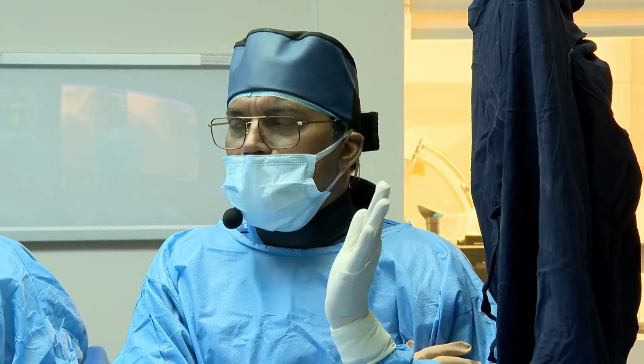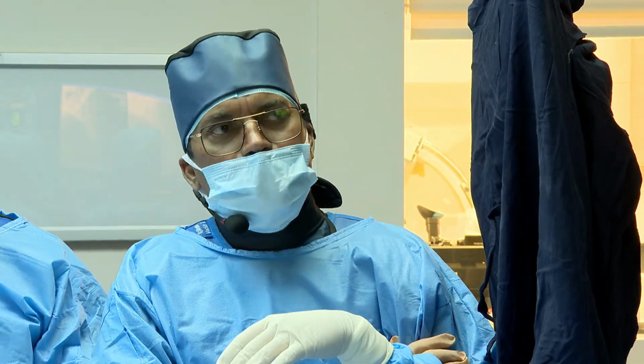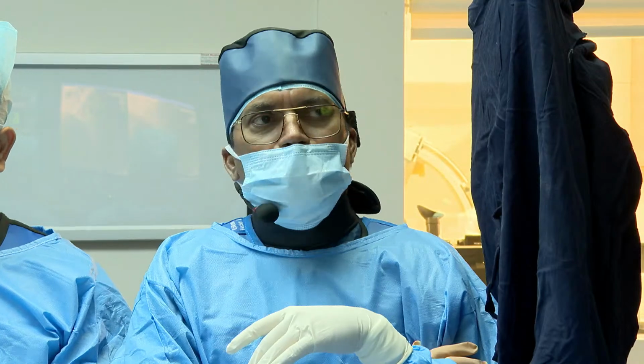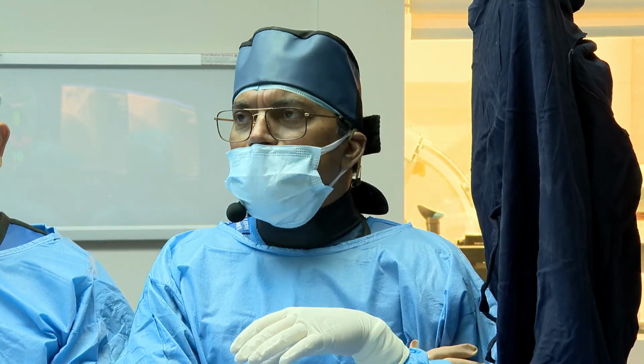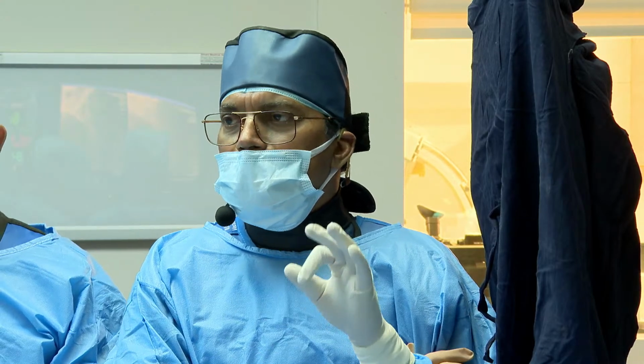whereas the cutting balloon creates clear cut incisions, and that is the reason the restenosis rate is also slightly less, and moreover expansion of the stent will be much better. More important, slippage of the balloon is less, and at the same time the formation of extensive dissection with intramural hematomas is less likely because of the controlled dissections.